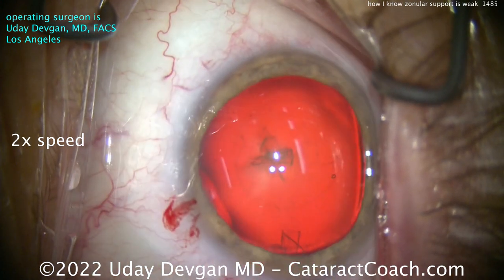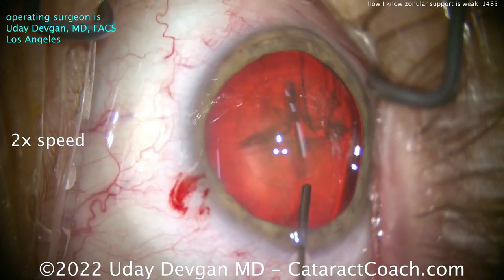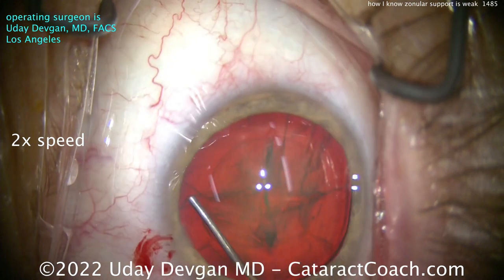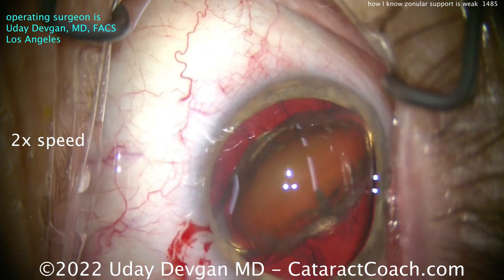Let's just try to get this lens up out of the bag a little bit. A little bit of hydrodissection here — there's a denser endonucleus. The peripheral part of the lens is pretty soft. There's that dense endonucleus, so I've got to tilt it up.